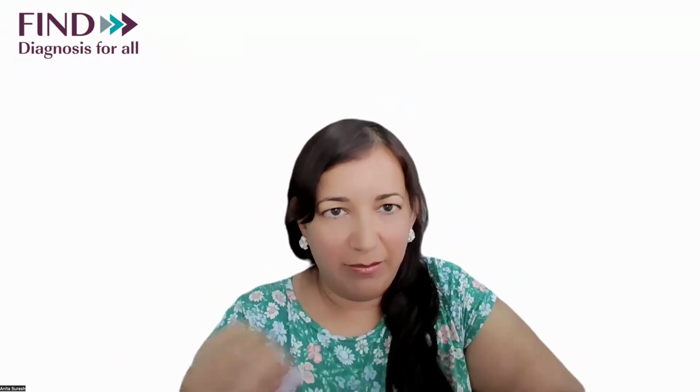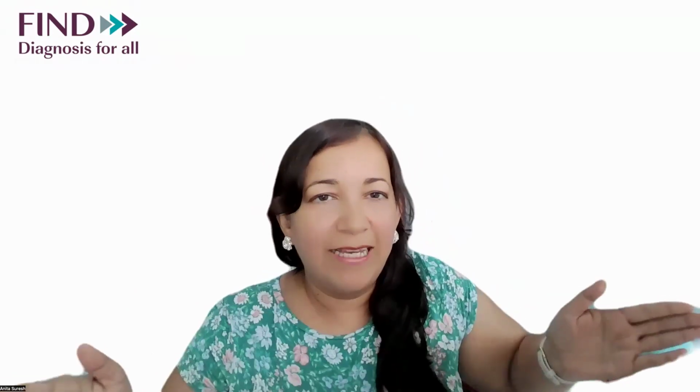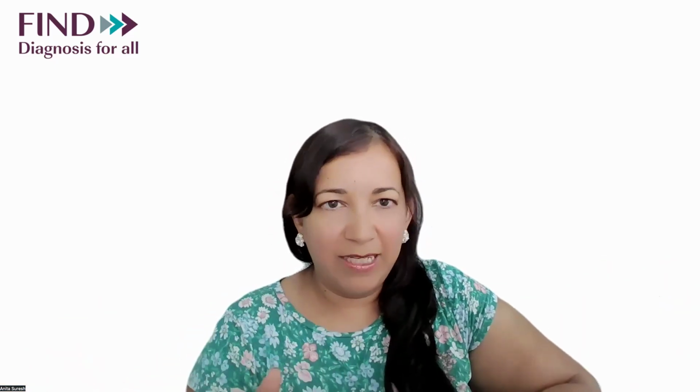But there's an inherent limitation in PCR because there's only so many targets you can fit in there. And it's also based on very specific SNPs and targets, right? Whereas with sequencing, they cover the entire genes and as many genes as you want, really. So that's why I think that comprehensive aspect is there.